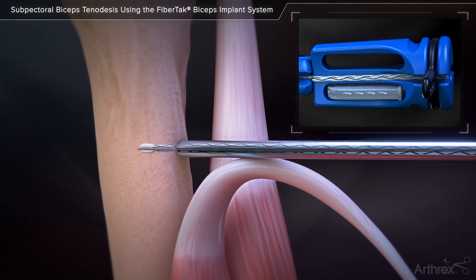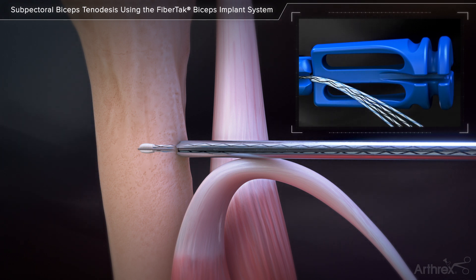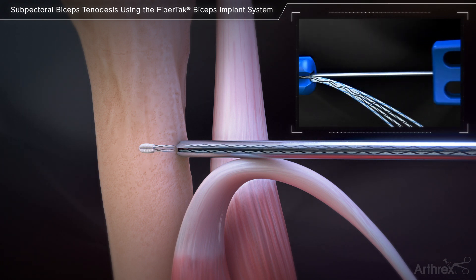The needle guard contains the four pre-attached needles. To remove the sutures, first remove the suture release tab and then free the needle guard and the sutures from the inserter handle. Remove the inserter from the drill guide.